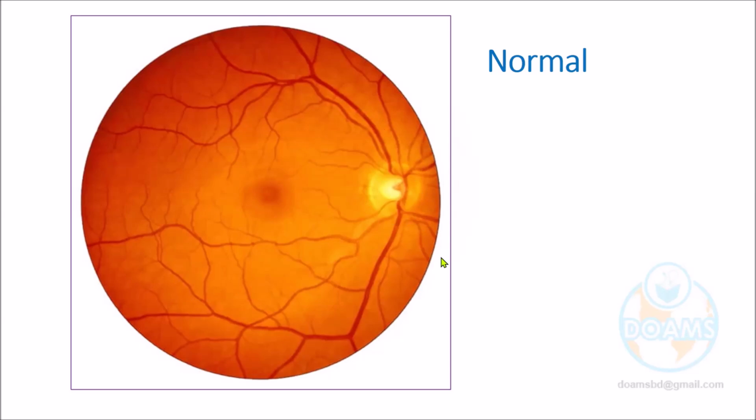Doctor, take care of the noise. In the optic disc, any additional comment, doctor? Anyone? Sir, in the optic disc, the margins are visible, no haziness. Okay. It's normal. Seems to be normal. What is this in the center? A relatively whiter area. It seems like protrusion. Sir, this is the optic nerve, sir.